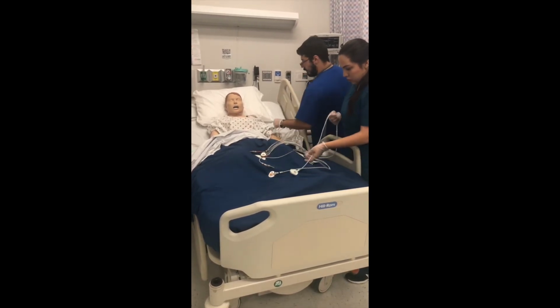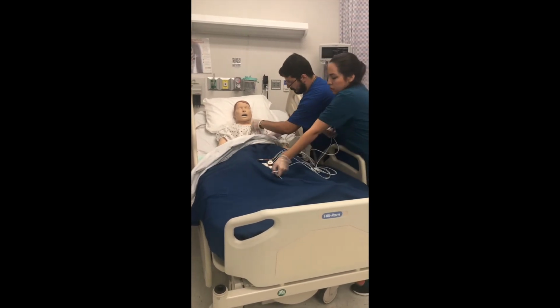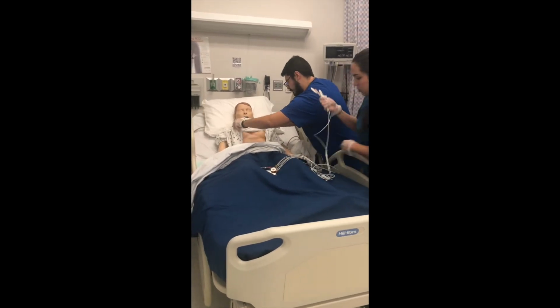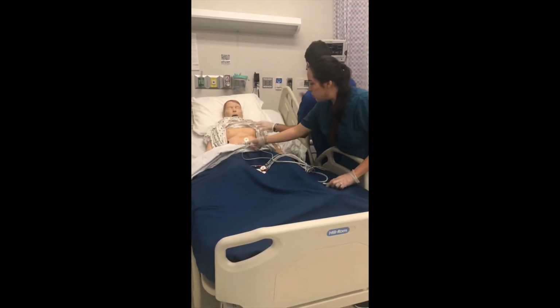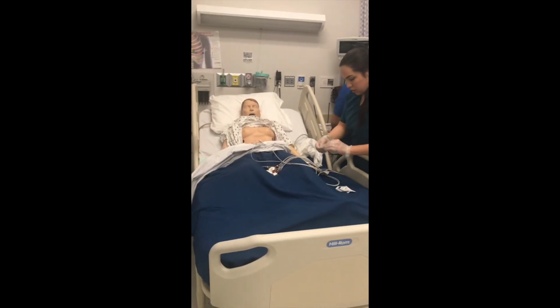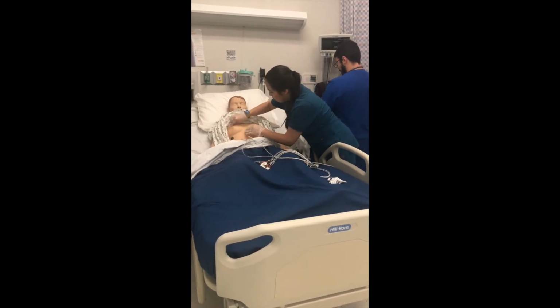coding. Okay, ma'am, we're going to have to expose you a little bit for this exam. Just going to lift up your gown here just for a couple of seconds. My colleague here is going to be placing the electrodes. I will be putting your information into my ECG machine, okay? I'm just going to go ahead and clean you with some alcohol pads, okay? You're a little cold.